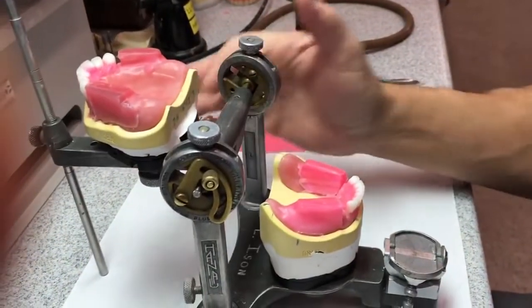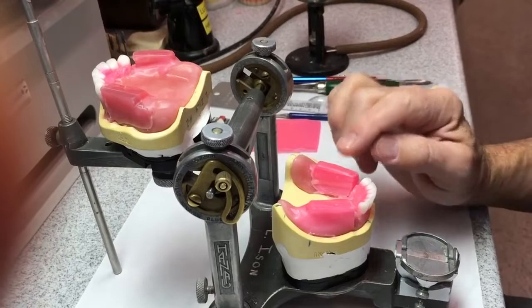We've got the maxillary mandibular anterior set. Now we're going to move on to the posteriors.